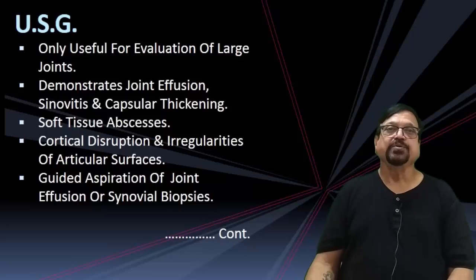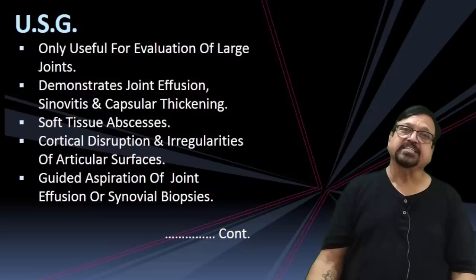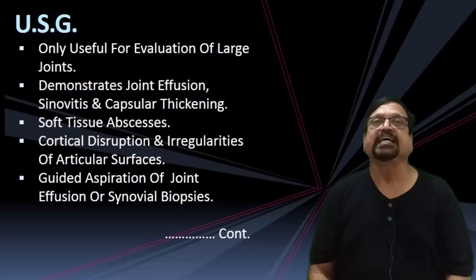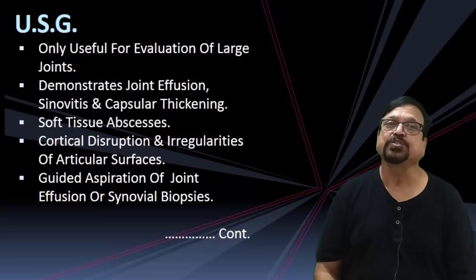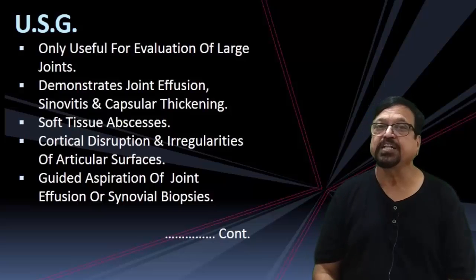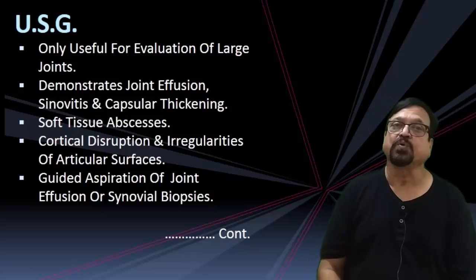Now USG. USG we are seeing as a supporting investigation in addition to the plain X-ray. It is only useful for evaluation of large joints. It doesn't work really in small joints, and it demonstrates fluid effusion. And if fluid effusion is there, then only USG has more role.